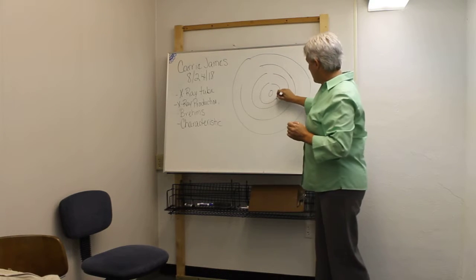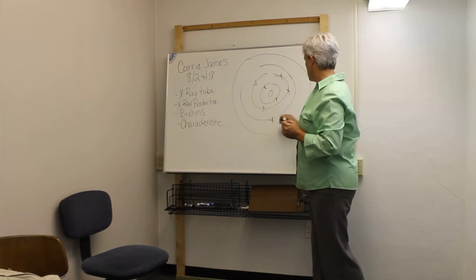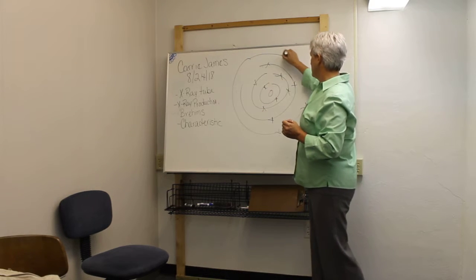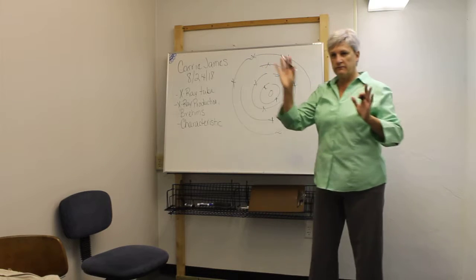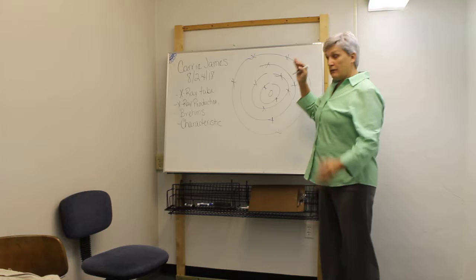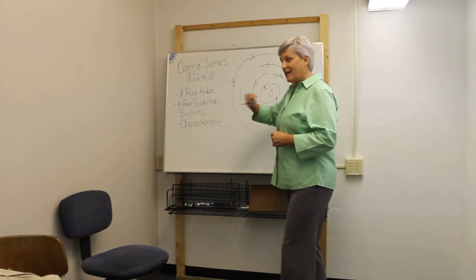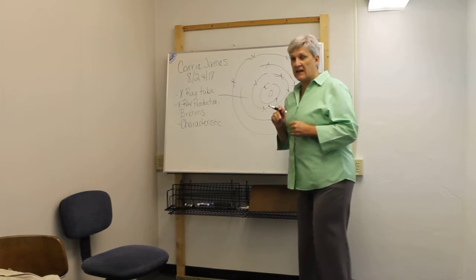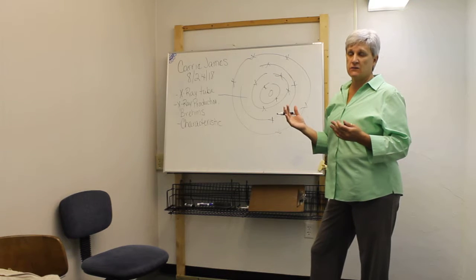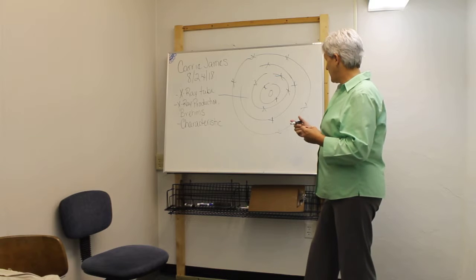Characteristic. So we've got our electrons. Again, I'm not going to fill them right, just give us an idea. We have electrons circling the nucleus, and there's an electron filling order. In this interaction, we have an electron coming in from the cathode. Now, what's the difference between this and Bremsstrahlung? It takes a certain amount of energy to make this happen.